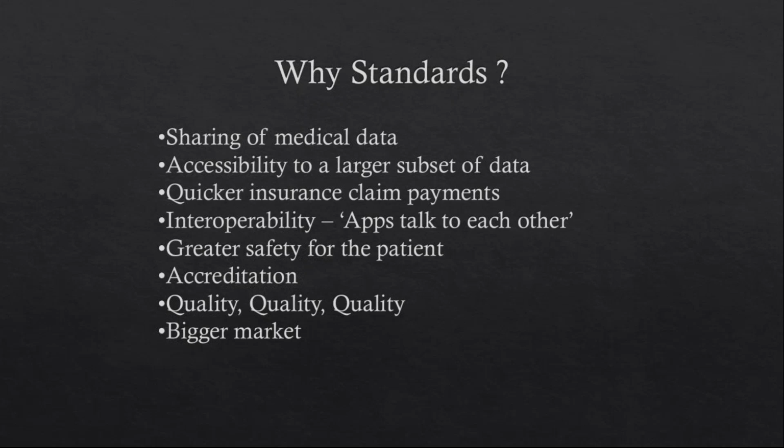And interoperability is nothing but the power of applications to talk with each other, which is generally enabled with the help of integration engines. So apps can talk to each other because of this particular HL7 standard. And at the end of the day, there is greater safety for the patient, as data is transacted in a systematic format, and the scope of error in transferring the data or transferring incorrect data is very low, which enables greater safety for the patients.